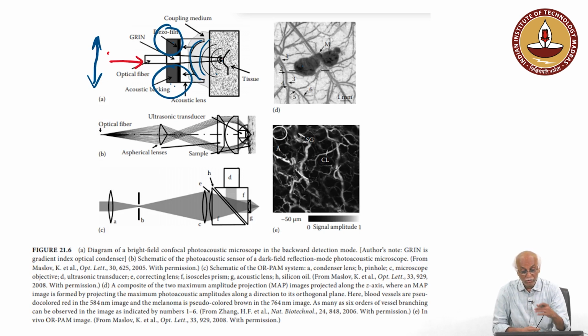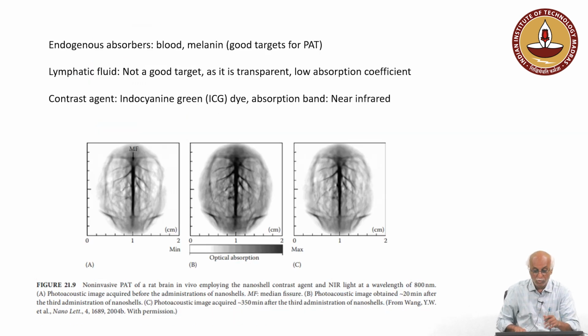Okay. So, these techniques are being used to capture, or being developed, I should say. Clinical applications are just starting up in various ways. However, this technique can allow us to image the blood clots or blood flow, not only blood flow, but also the vasculature, how the blood is flowing all around. It can be captured by using a two-dimensional imaging modality. So, that is one more such example.